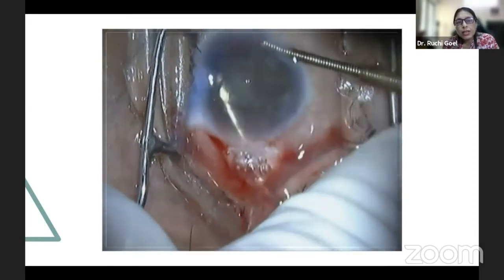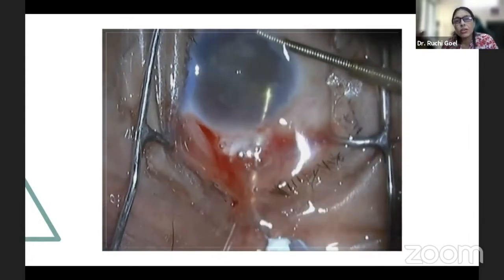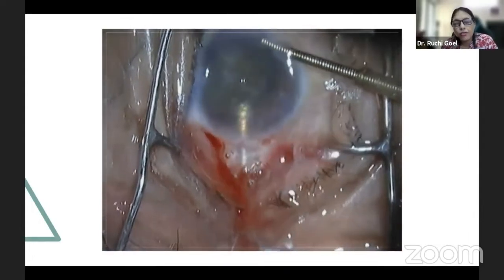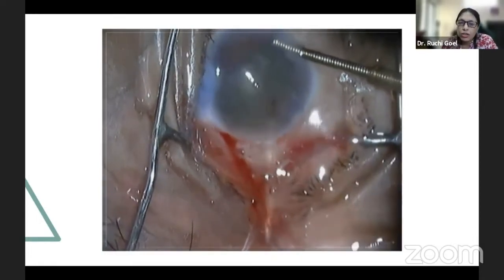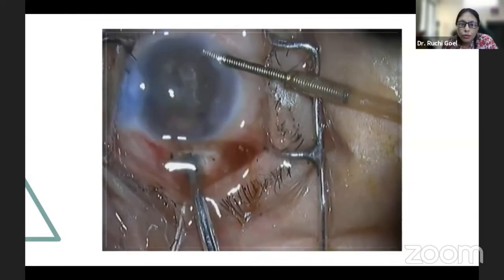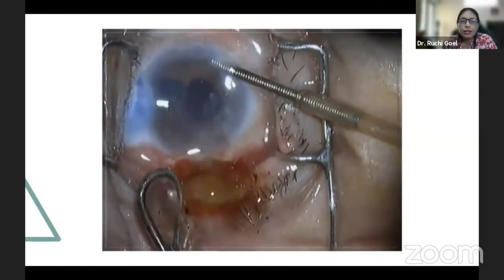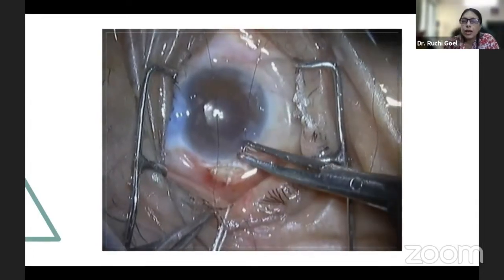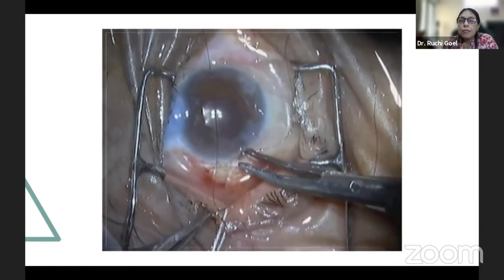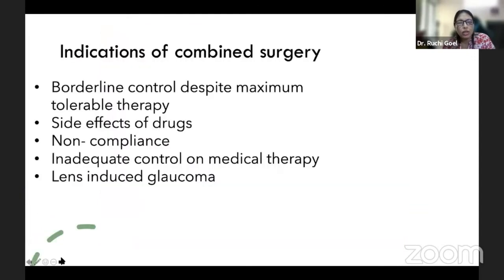Now, sometimes in these patients, because of the bleb and the hypotony, the hydropressure created by ACM does not suffice, and the nucleus does not move because enough hydropressure has to be created. So I have used microvectis to assist my delivery in this case. And this is why we advocate that one should be well conversant with all the kinds of SICS technique, because no one technique is going to fit all the cases. So one must know when to interchange.